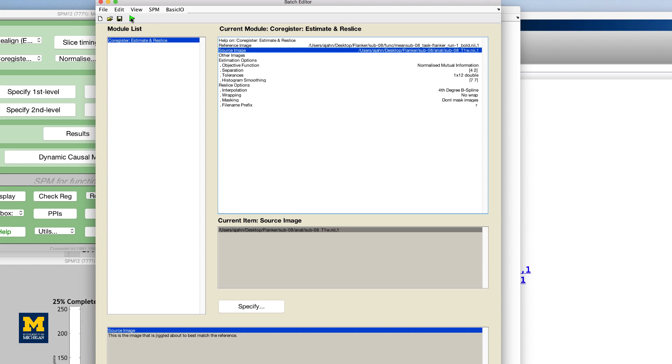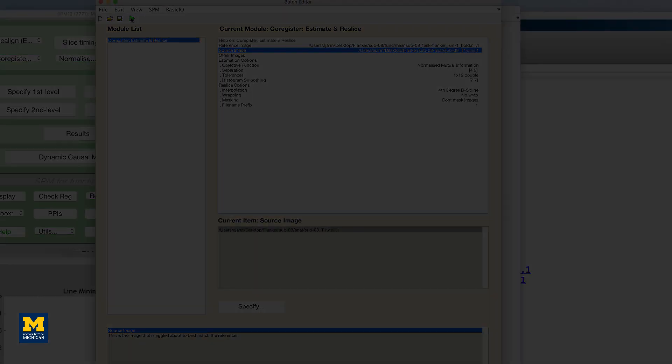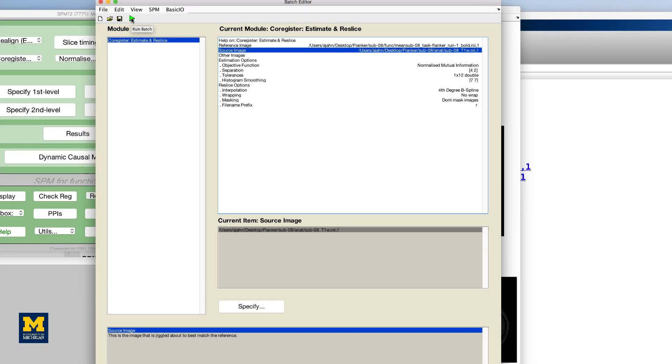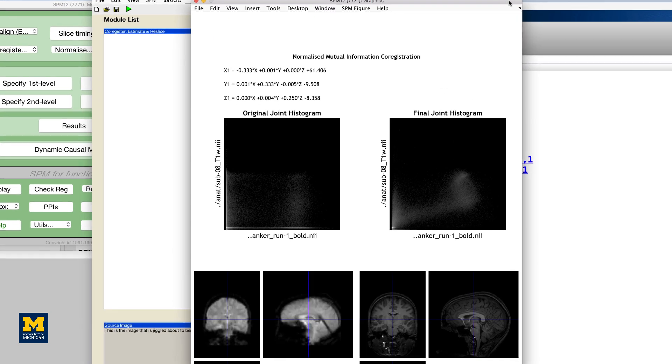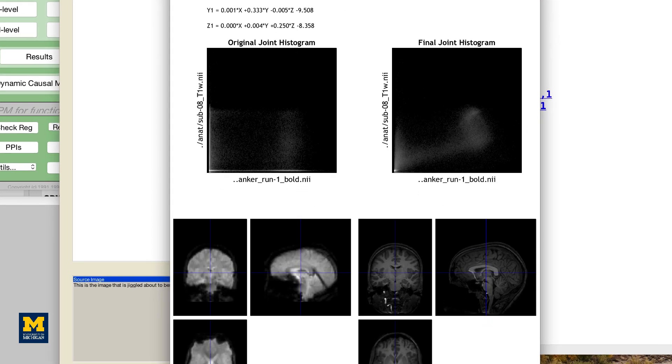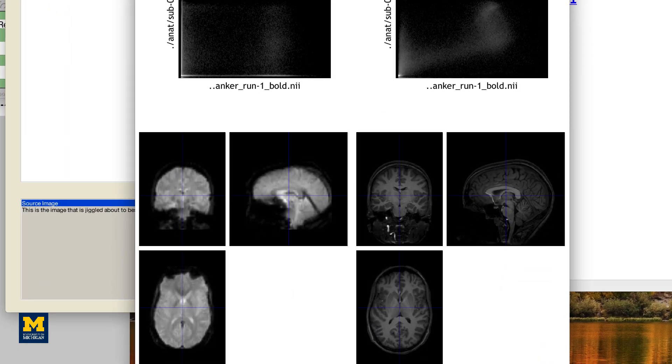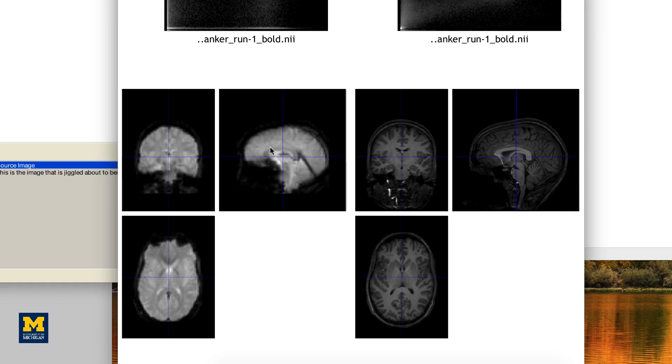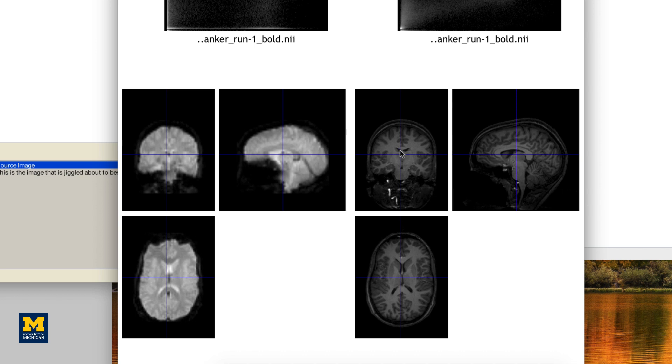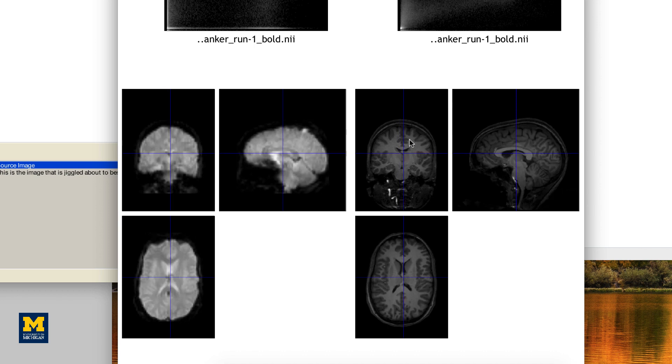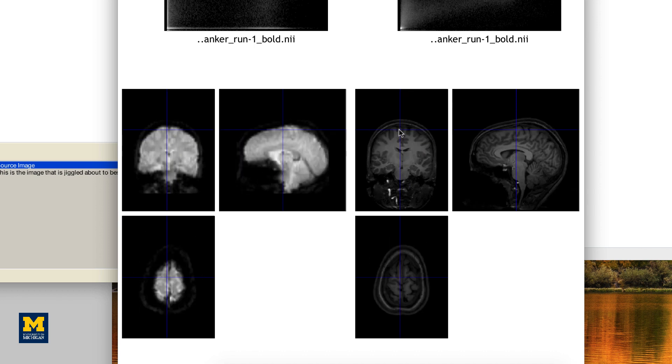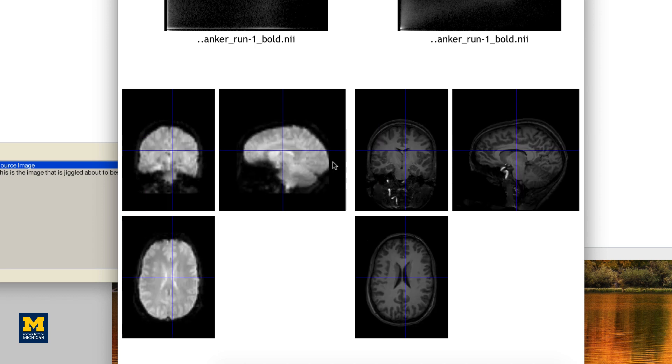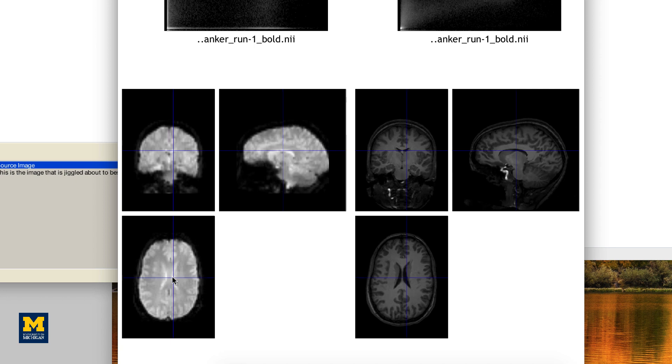Then click the green go button. This step should only take a few moments. When it finishes, another window will be generated, showing the co-registration results with the mean functional image on the left and the anatomical image on the right. Click and drag the crosshairs in either image to see how well the images are aligned. In addition to the outlines of the brains being matched, you should also check to make sure that internal structures, such as the ventricles, are aligned as well.